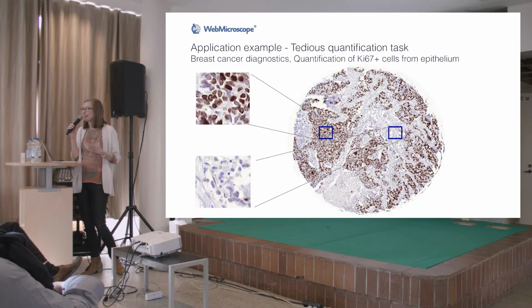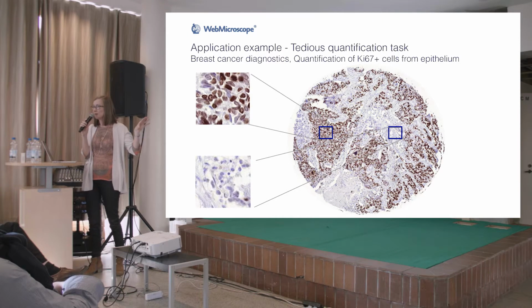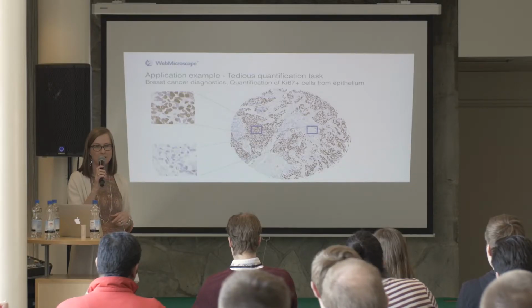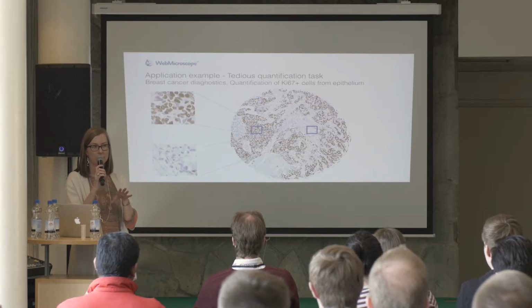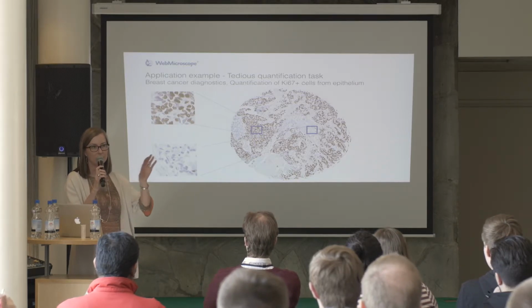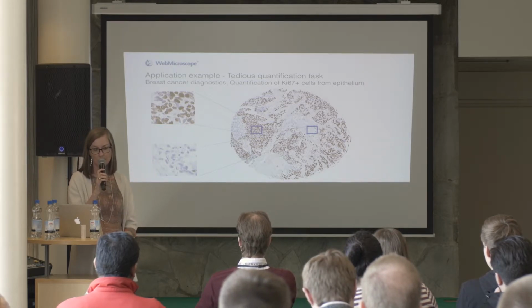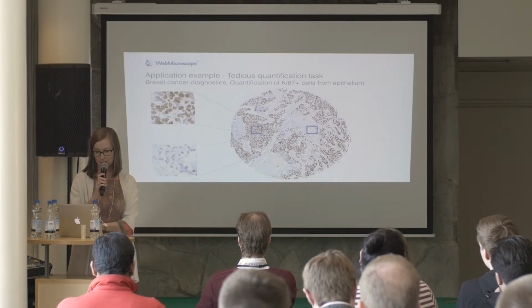And actually, in this application, we have a benefit of having a lot of image data in one single sample already. These are huge files, so we cannot annotate them completely. So we start taking these sort of snapshots from these huge files and then annotate them very carefully. And this is an iterative process, the training. So we do first something, then we see how well it works, and see where it didn't work, and then we take more snapshots for the training and retrain the network again and again until we reach the desired level of sensitivity and specificity.